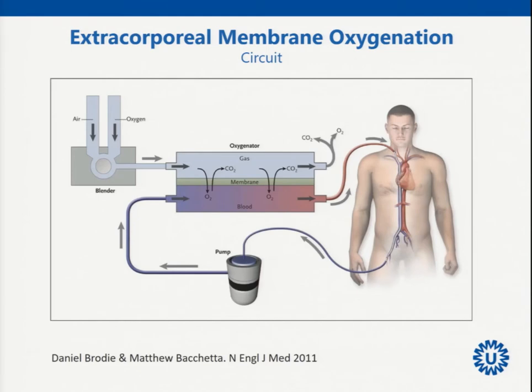then you can imagine that you get here a 100% saturation and a PaO2, which is very high, probably 200, 300, or 400, depending a little on the quality of your oxygenator and the duration that the oxygenator is within the circuit with the patient. So after days and weeks, the quality and the functionality of the oxygenator can deteriorate.